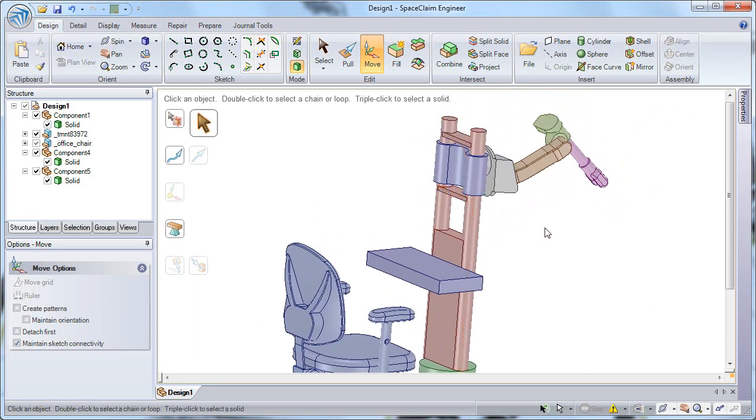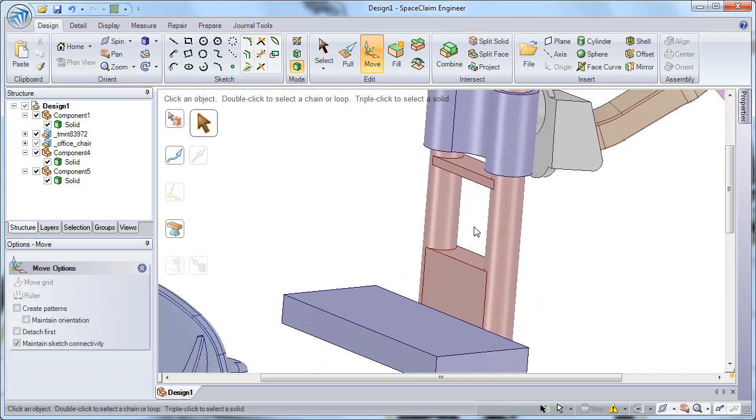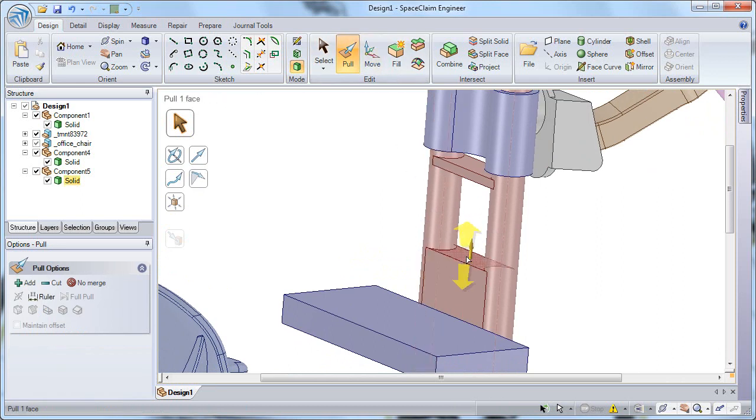So I'd now like to create some additional geometry. We want to put a monitor into this medical cart assembly. So I'm going to start building that without having to sketch any new component. I'll use the existing features that I have on screen. So using my Pull tool, if I select on an edge by default using the Pull tool, it's going to create a round on that edge. And you can see that on screen there when I pull on that mounting tower.